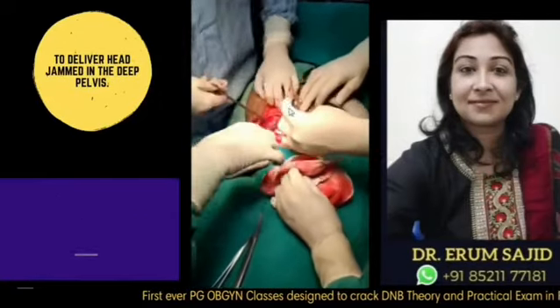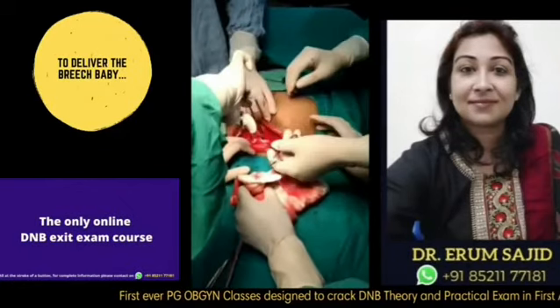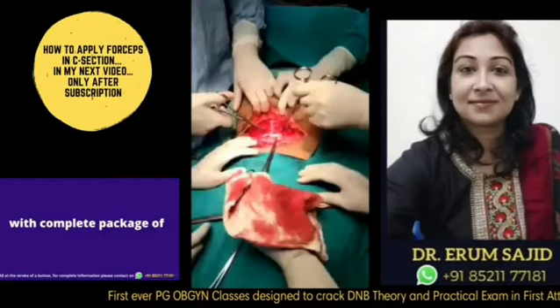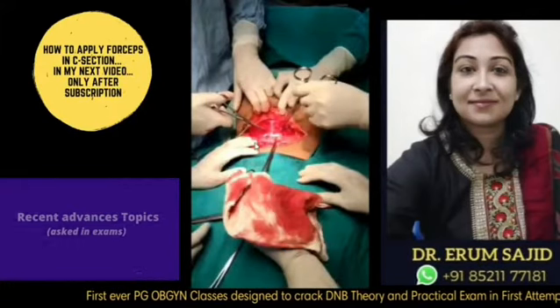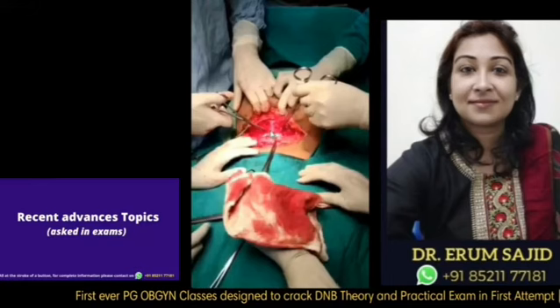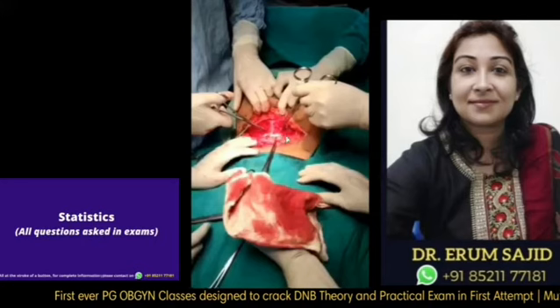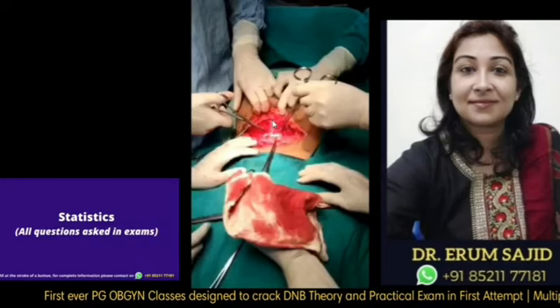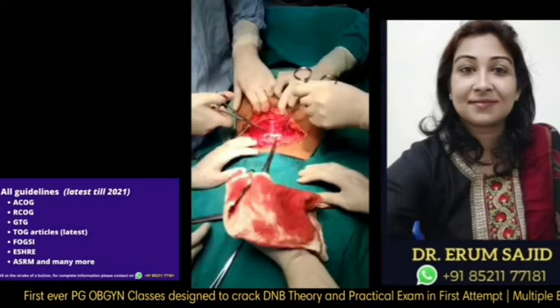Now I'm holding the muscle belly. See, I like to stress something over here. Have a look at this rectus belly. This place is where I'm holding my Allis forceps, and I asked my assistant to hold this part of the rectus belly, but she was trying to hold somewhere in between. So what do I do with this?